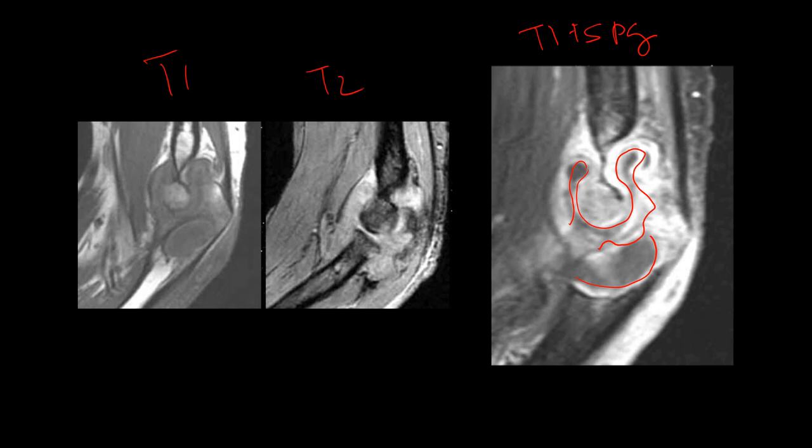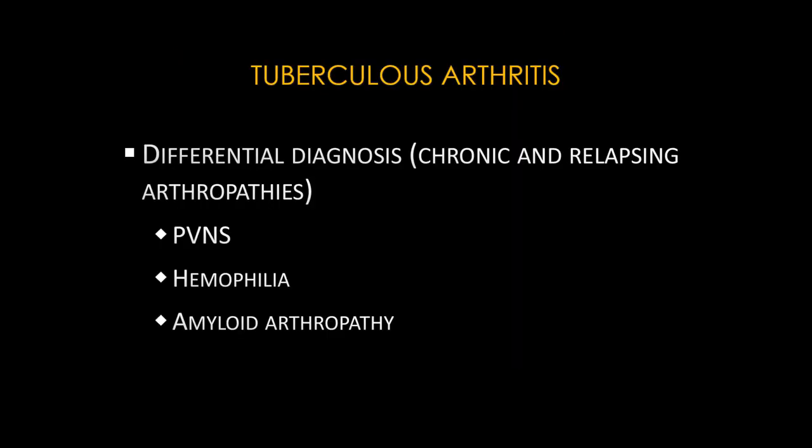On T2 there is extensive synovitis. With this radiograph and MRI we can get to a diagnosis of a chronic relapsing arthropathy that is still active. The differential diagnosis would include tuberculosis arthritis (which was this case), PVNS, hemophilia, and amyloid arthropathy.